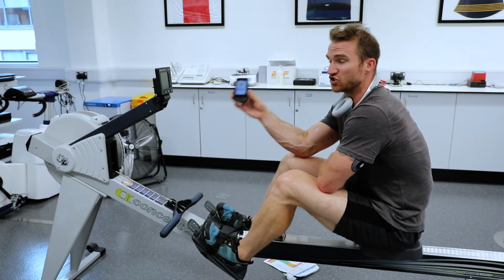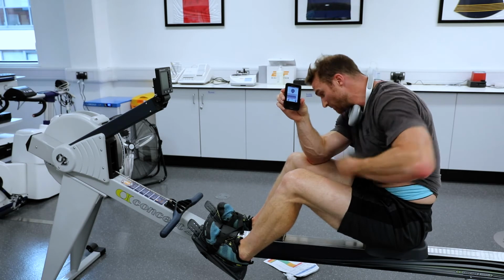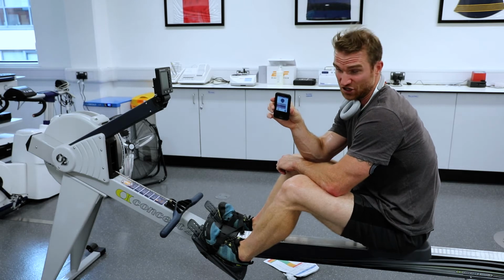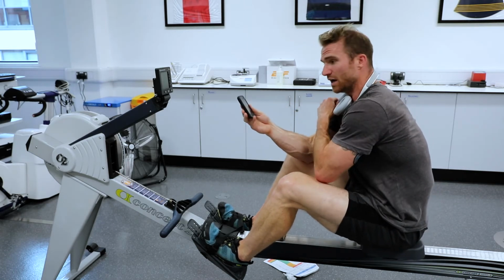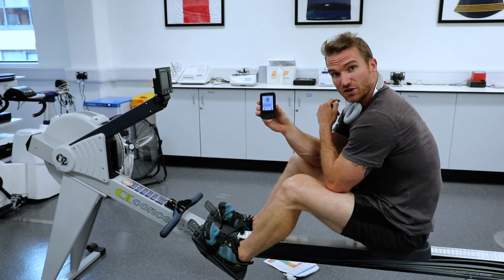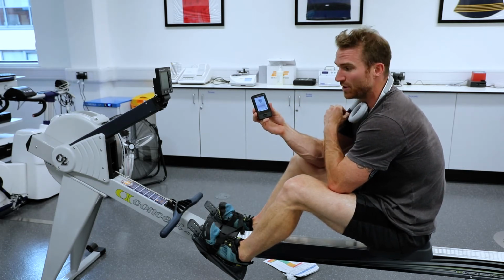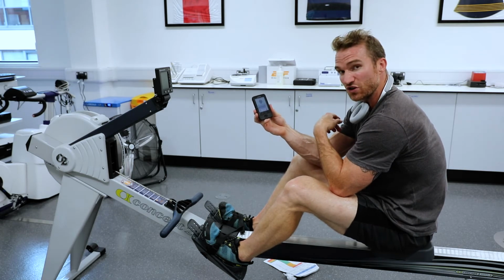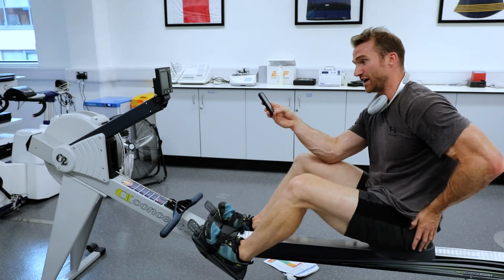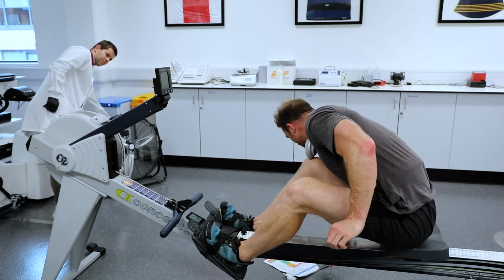I've got my alarm. You see now it says 6 and down, so it's caught right up. So it's a good 5 minutes behind. So those 8 dextrose tablets are down. I've got my alarm set at 5.6, so I've no doubt that this will go off in the next 5 minutes or so. But because I've already swallowed those dextrose tablets, they won't have kicked in yet, so I don't need to get too alarmed when it goes off at 5.6 because I've already made the treatment decision of having those. So I'm going to hop back on the rower now for the final 20 minutes. Still a chance I might go low, but that'll be to see.